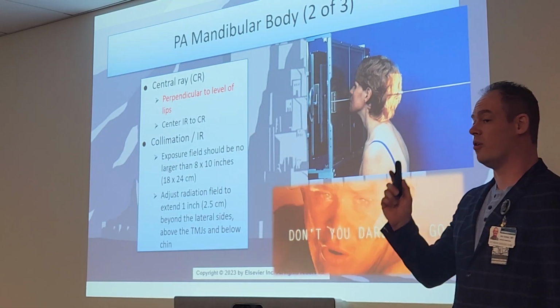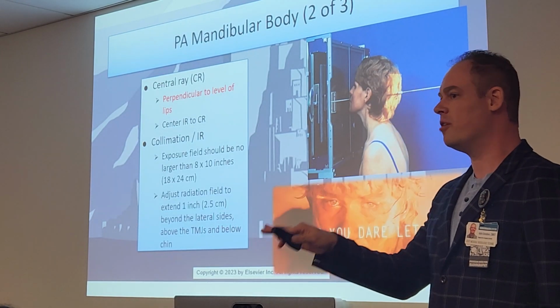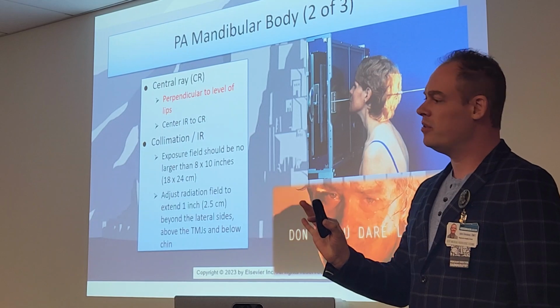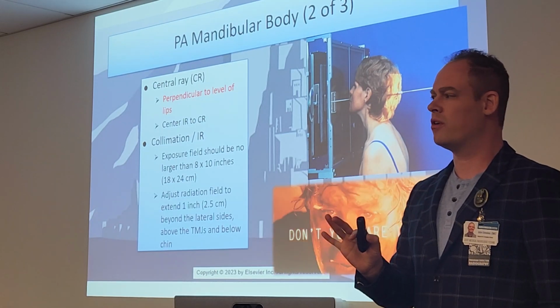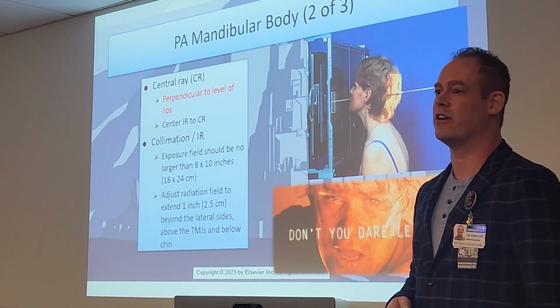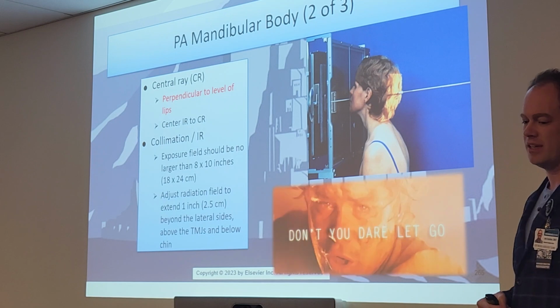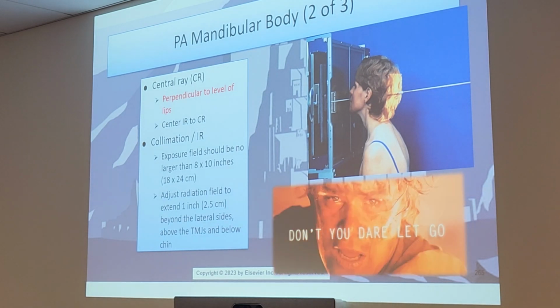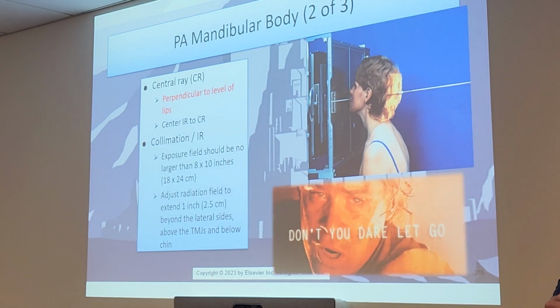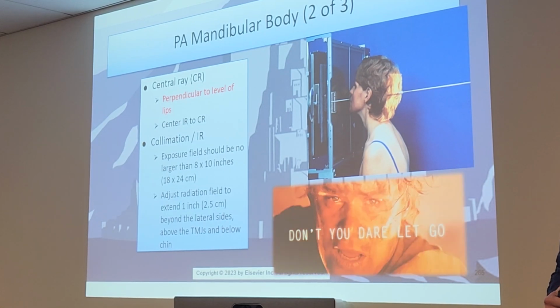And let me give y'all a little pro tip on that, because you're gonna get in some really bloody OR or C-arm cases. My best advice to you is, as soon as that case is over, before you do anything else, clean it off. When that blood dries, you're gonna be sitting there for an hour scrubbing that blood off. If you put hydrogen peroxide, it takes it off really quick. It's still painful if it's dried up. Try to get it while it's still fresh and non-coagulated.